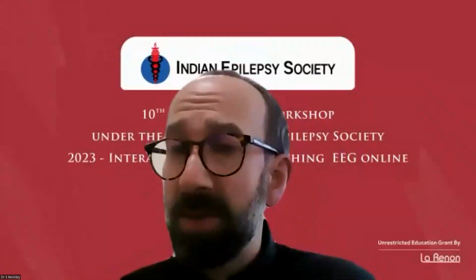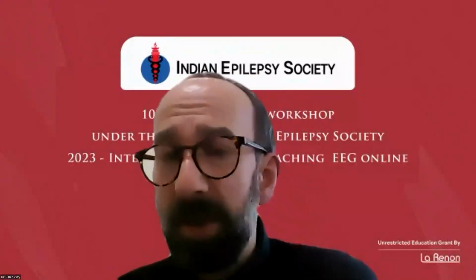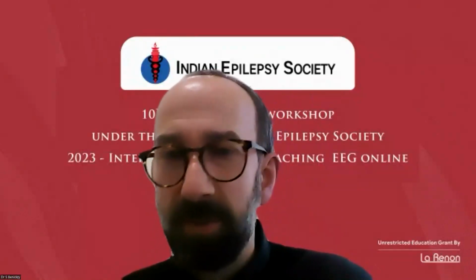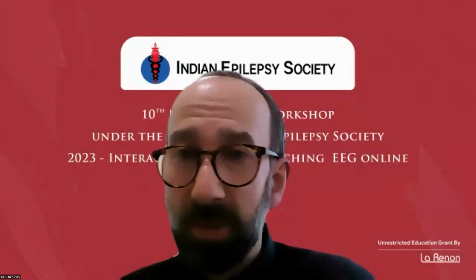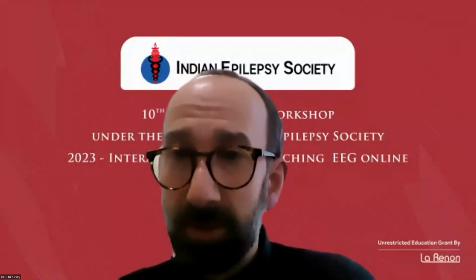Yeah. But again, this depends on the condition. If you see this in a post-anoxic patient, then you know that you gave lots of medication to suppress this epileptiform pattern. The patient is not doing better because the prognosis is rather poor because of the etiology. Now, in cases with a good prognosis, usually I can see clinical improvement, although it can lag behind, so it can come later than the EEG improvement. If the etiology makes it possible, then the clinical improvement will follow. But whether it will follow or not depends very much on the etiology.